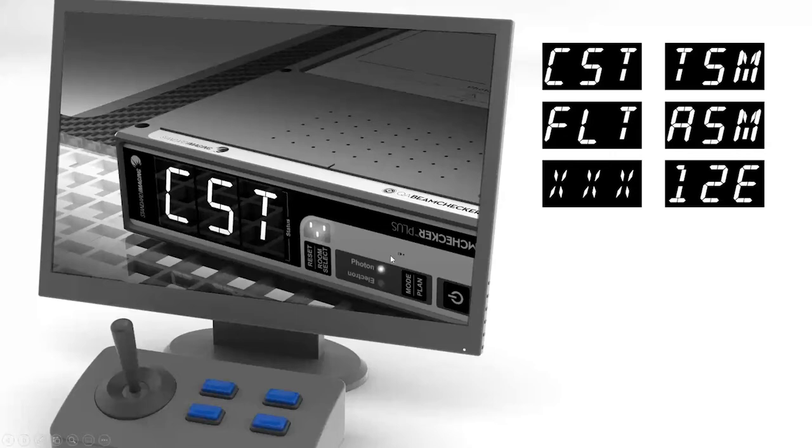All those errors, all that information is stored, and it does download from the device later. But then it will reset and go to ready to go. If there does happen to be an action 2 error, then the device beeps much more insistently, I believe about 3 times a second, and the beeping noise is louder as well, to alert you for safety's sake that an error has occurred.